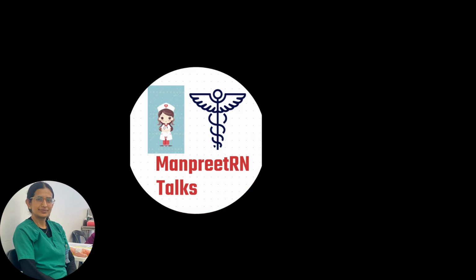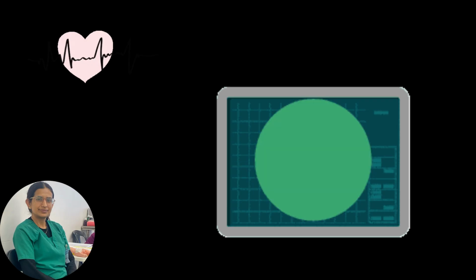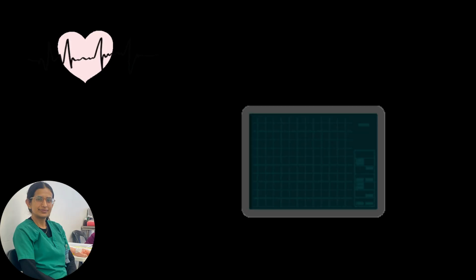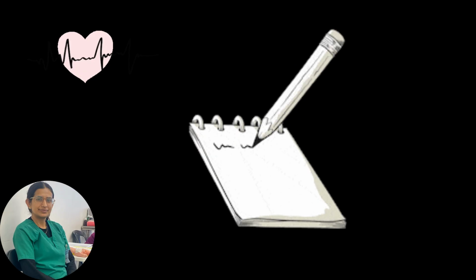So, must watch. Today we are going to break down ECG interpretation in a simple way so you can remember it in a very clear method. Many students think ECG is very difficult, but trust me, once you understand the pattern and the logic, it will become very easy for you. So, grab your notes and keep writing.